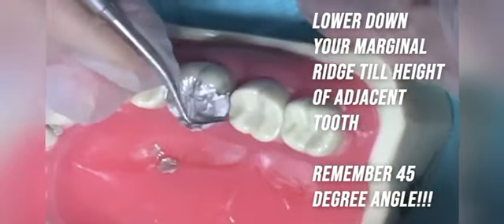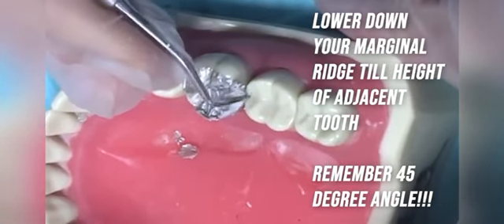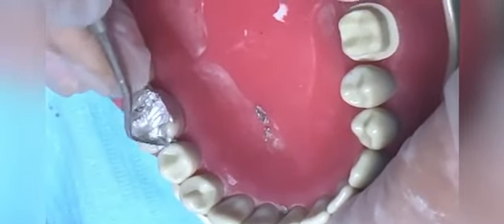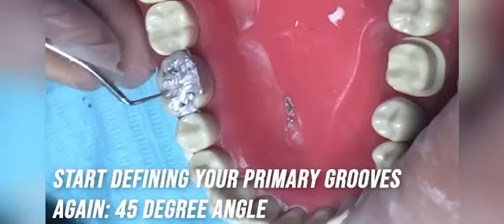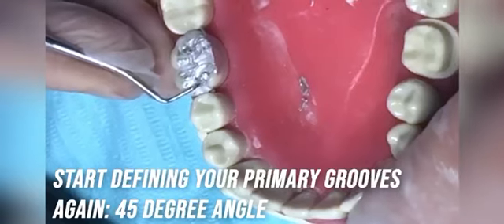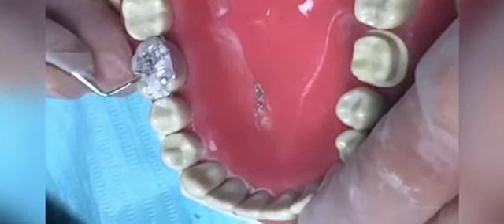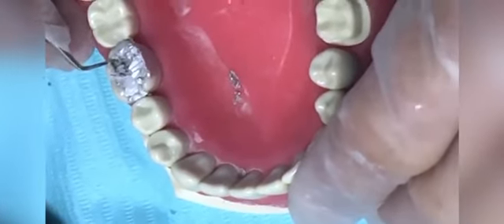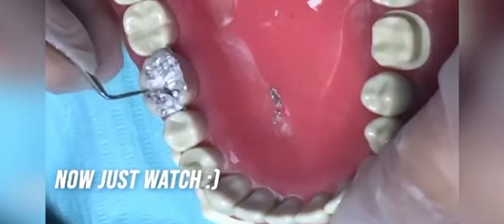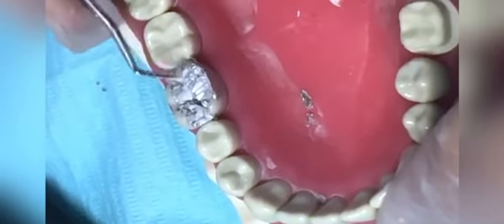Now on the distal side, we are going to create the distal cusp. Just remember, the criteria is about matching the marginal ridge height. Distally, you will get the distal cusp tip, which will always be a little bit high. While you are doing the mesial part, you need to create the mesial triangular fossa. So keep that in mind. And mesially, you will get the V-shaped area when you see from the side. So try to create that V-shaped part mesially in the contact area. The contact will be a little bit more buccal on the mesial part.